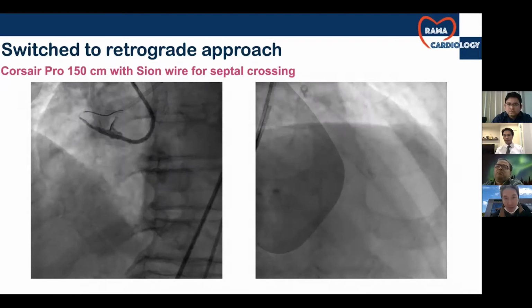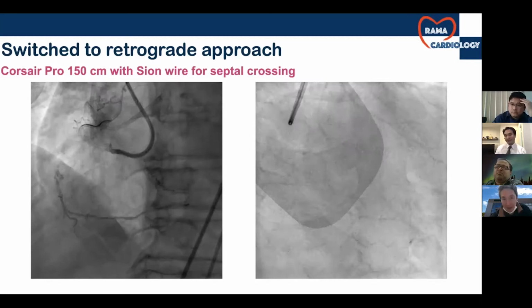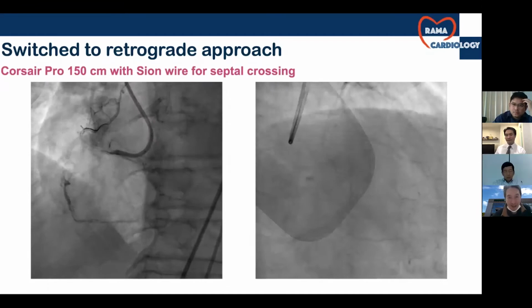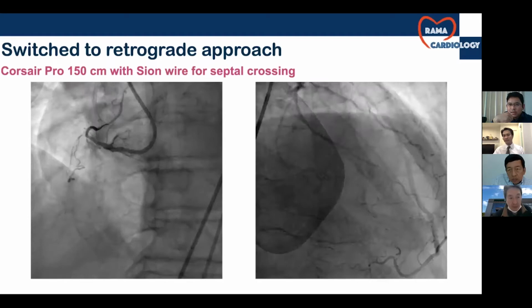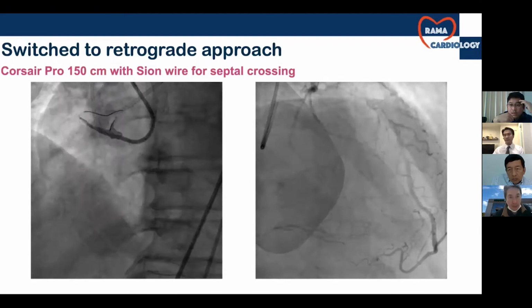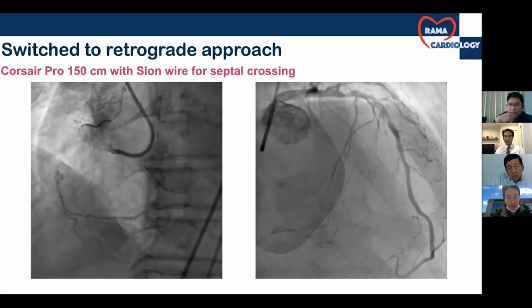Dr. Kisera took a very complex channel. It was very difficult because it goes down, then the channel goes to the apical side and comes back, and it is sometimes difficult to come back. It's great. And in this case, Dr. Kisera showed us that from the tip injection, we could not see clearly the connection, and he did the septal surfing. Do you have any advice on the technique to do the septal surfing? Which wire, or how to get the channel?